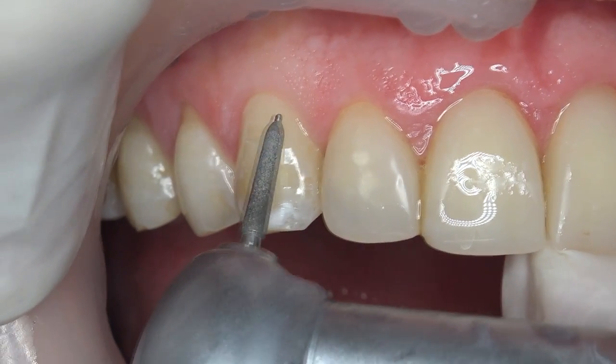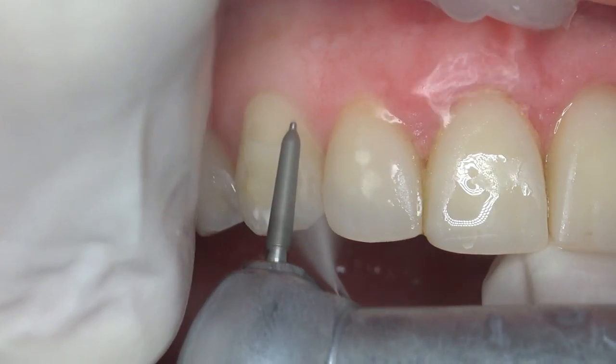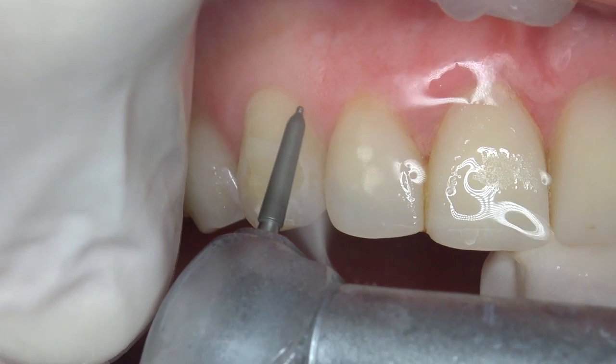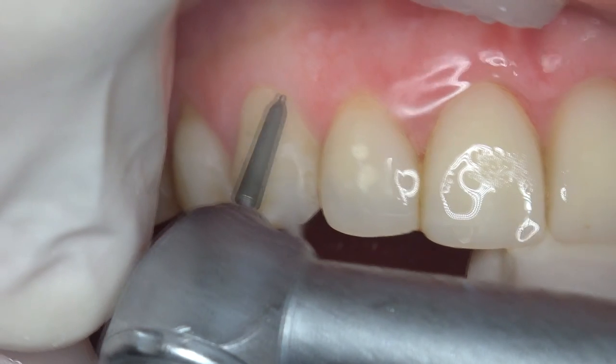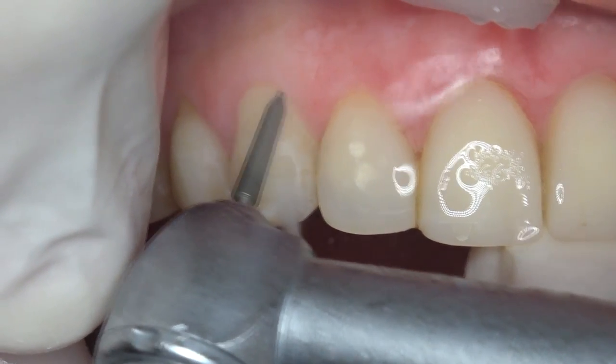Margin has two main functions for tooth preparation. The first is to achieve sufficient space for the restorative material at the margin. The second is to indicate the dental technician where the margin will end at the gingival area.